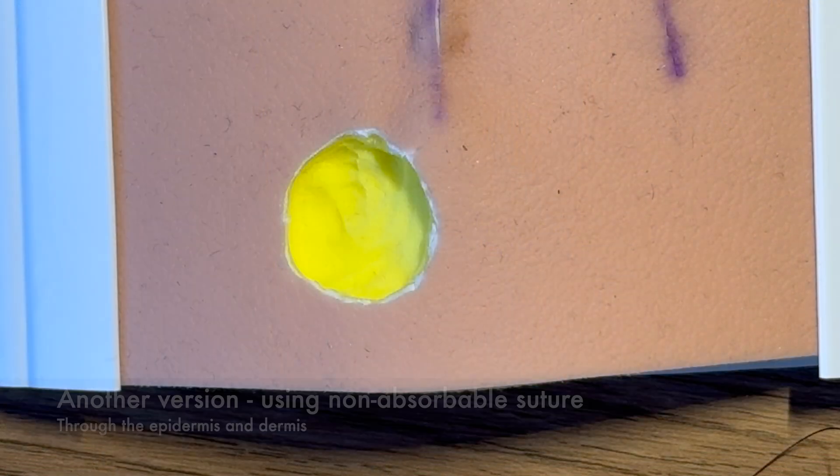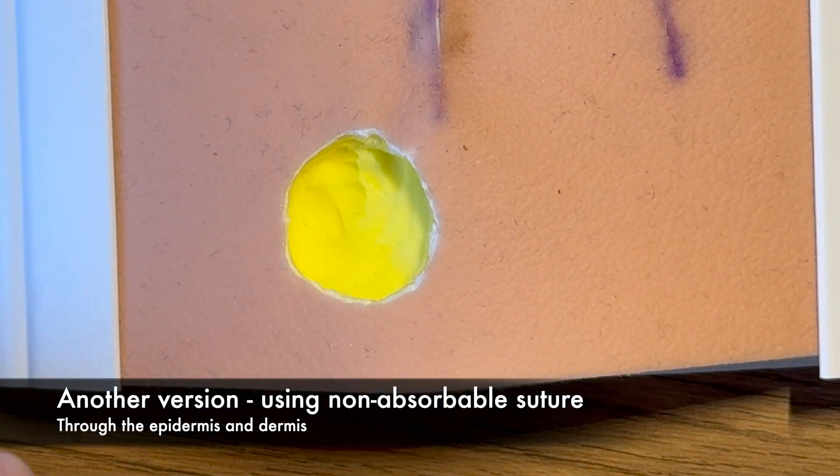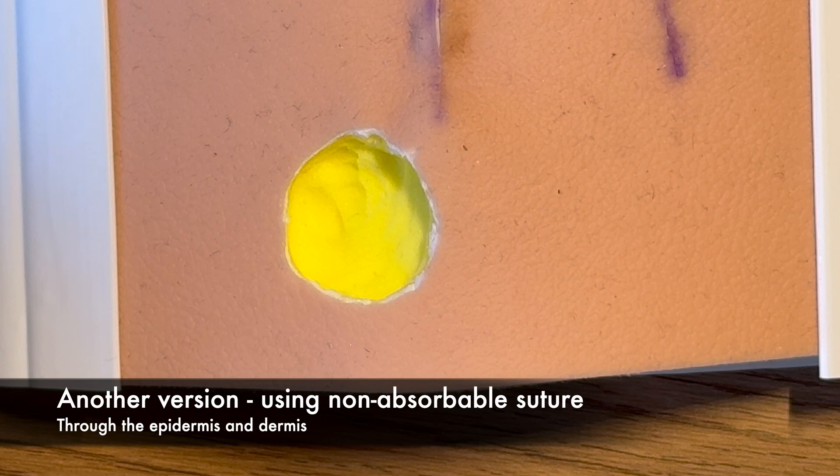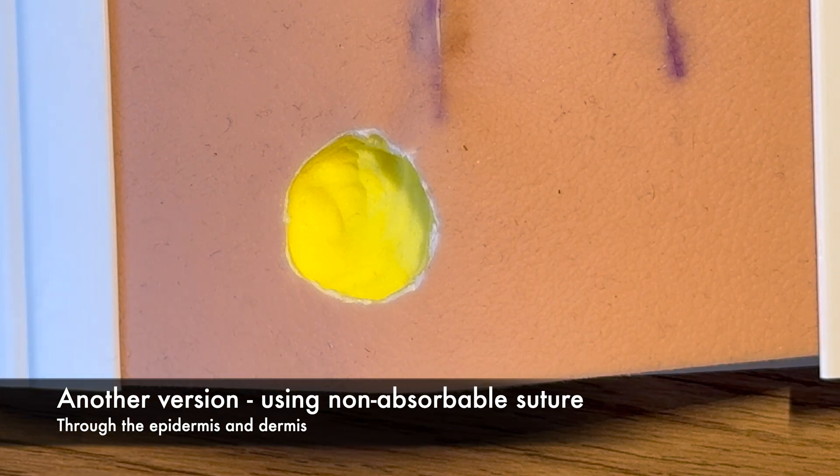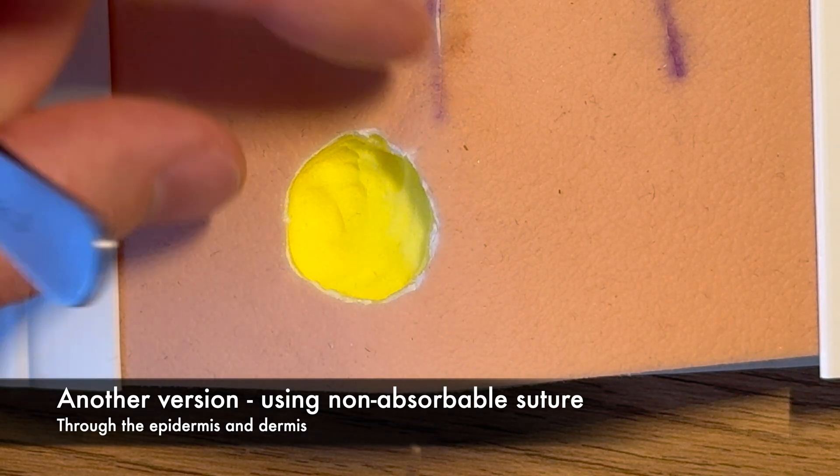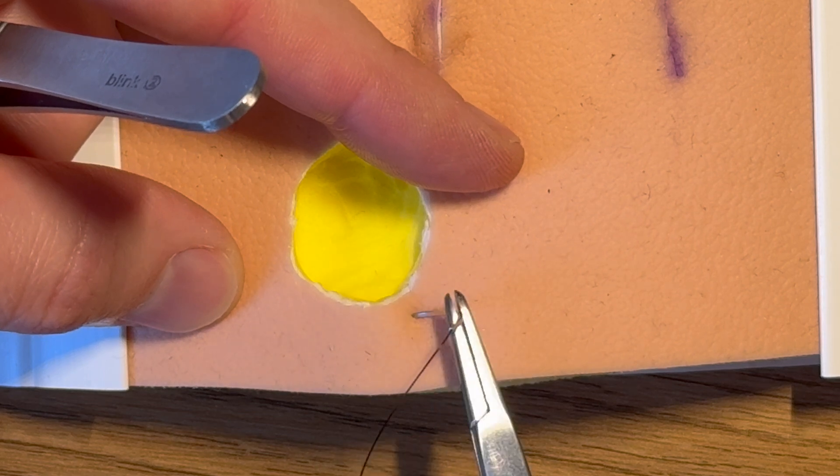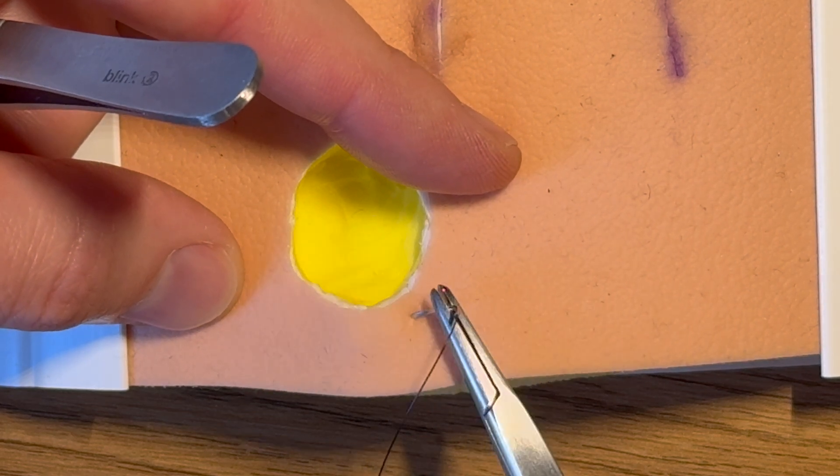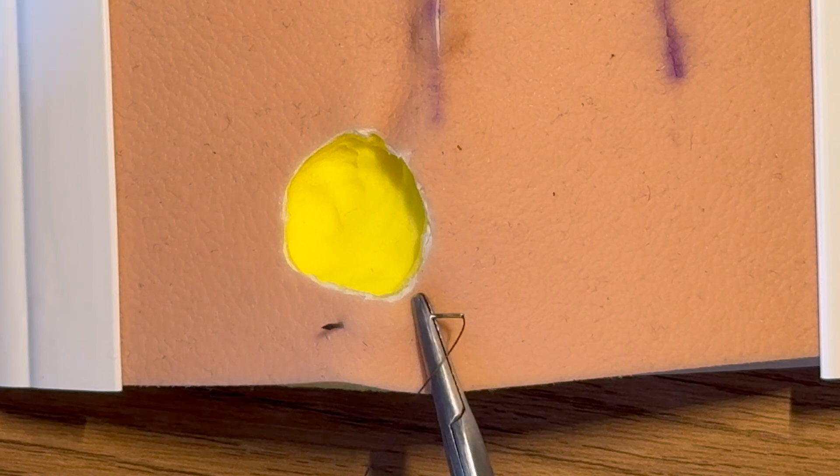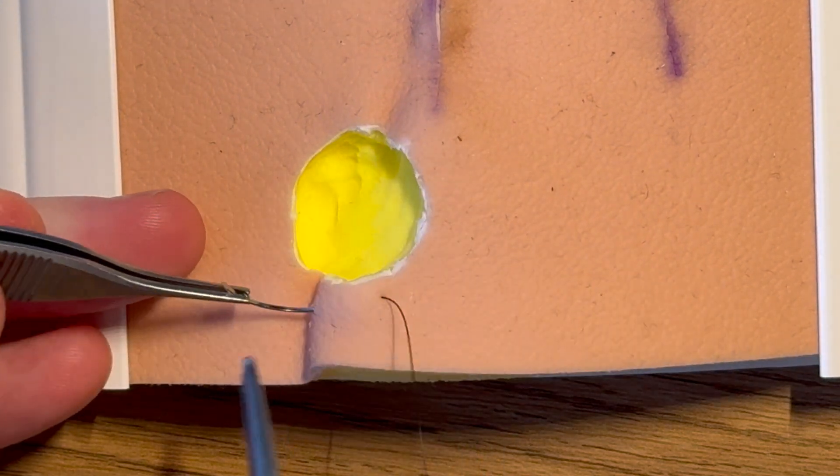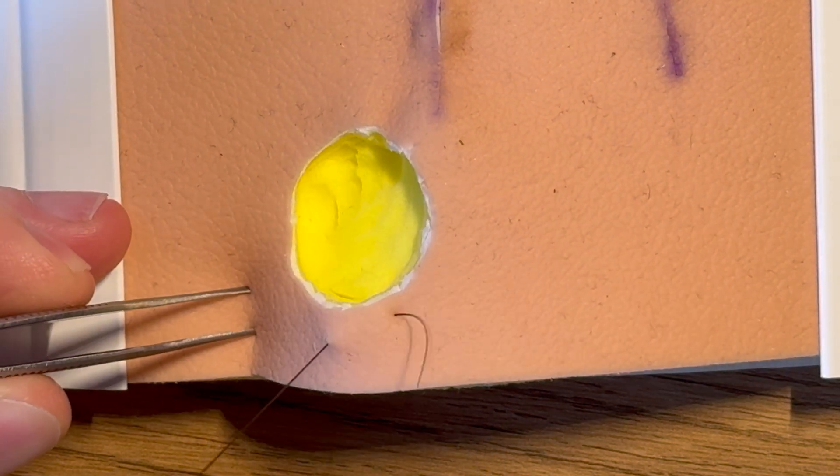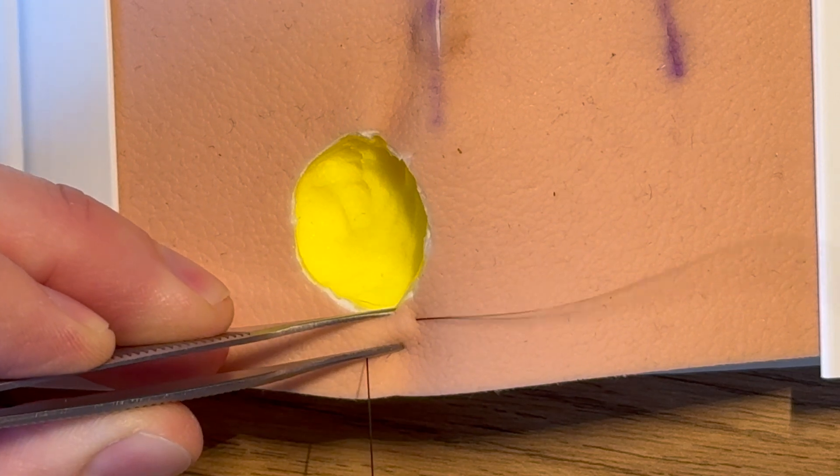So useful technique. So the other way of doing a purse string suture is with a non-absorbable stitch going through the skin surface, and then you take it out after a period of time, probably 10 to 14 days. So when you're doing that, you would go in a little bit back from the skin so that it's not going to tear through. You'd come out normally, take only about a half to a third of the curvature of the needle.